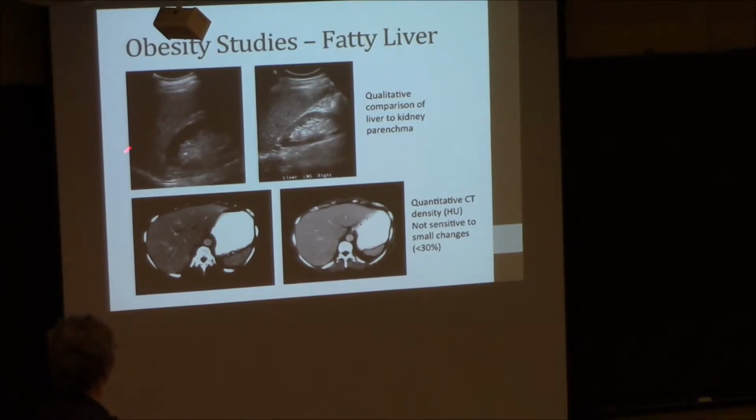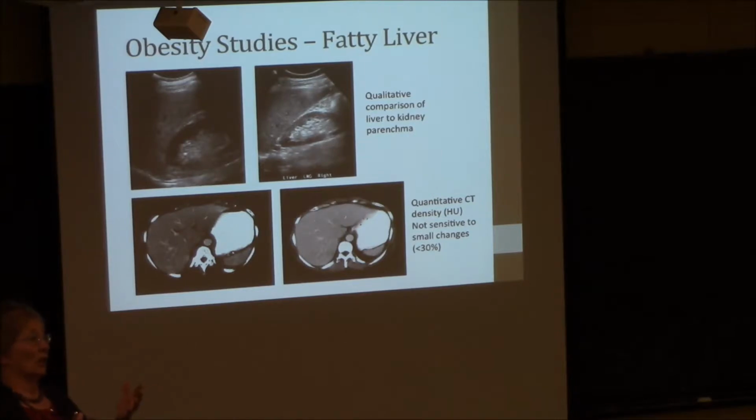One is ultrasound. So this is a fatty liver, and the only way you know it is that this is a kidney. Here's the top of the abdomen. You're looking through the liver here. The kidney's sitting behind the liver. If the parenchyma of the kidney is darker than the overall intensity of the liver, then the liver has fat in it. Now, ultrasound, unfortunately, is not very quantitative, and that's a huge area of work that needs to be done. The reality is, it's not quantitative because it was analog until probably 5, 6 years ago. So you just had these analog screenshots to work with. Here's a normal liver and a normal kidney where they're about the same. So that was kind of the thing, oh, okay, you've got a fatty liver.